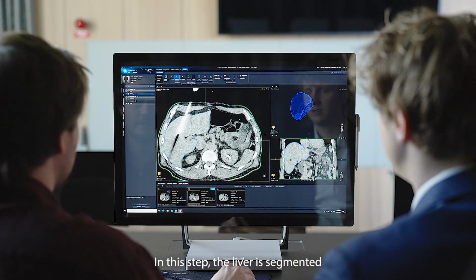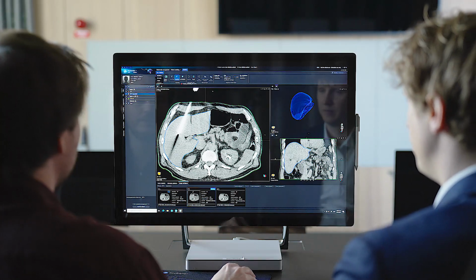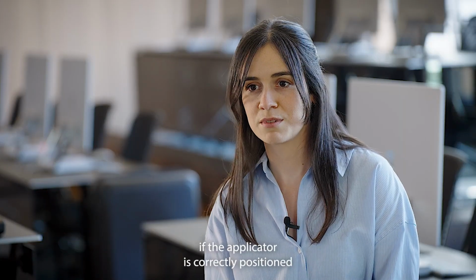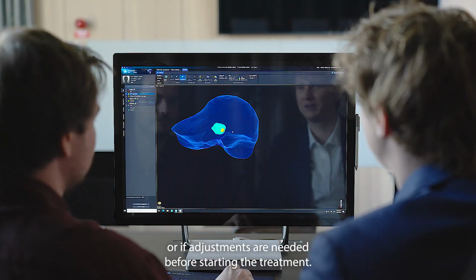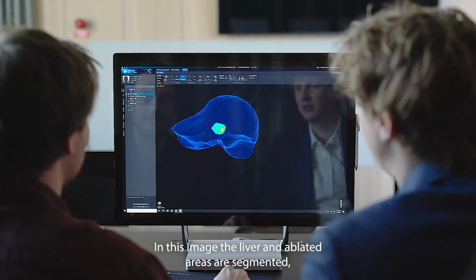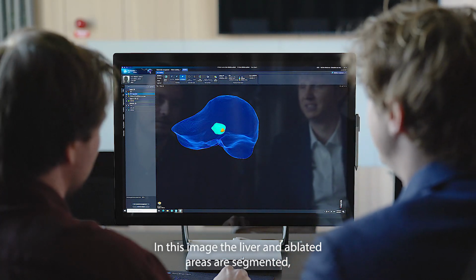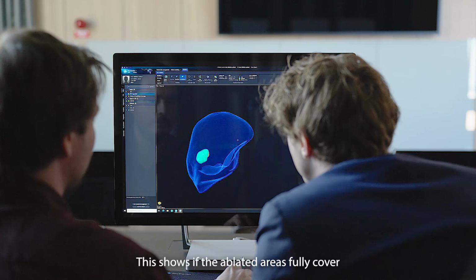In this step, the liver is segmented and the tumor is mapped from the planning image to this image. This step can show if the applicator is correctly positioned or if adjustments are needed before starting the treatment. Finally, a verification image is taken. In this image, the liver and ablated areas are segmented and the tumor is mapped. This shows if the ablated areas fully cover the tumor.